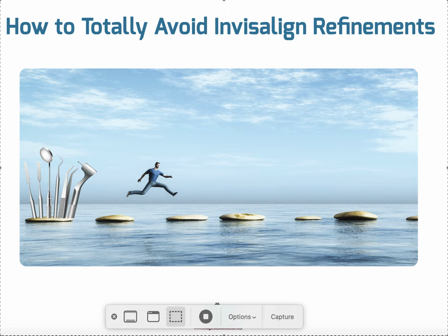Of course, Invisalign has the virtual check-in app. You can also use dental monitoring. You can also use GP ortho tracking and other ones. You can create your own in-house system, whatever, do whatever you want. If you do a combination of that and having the patient check in before every aligner change, I know it's a lot of check-ins and you're going to get more emails and you're going to get more alerts. You can have someone in your practice run it.